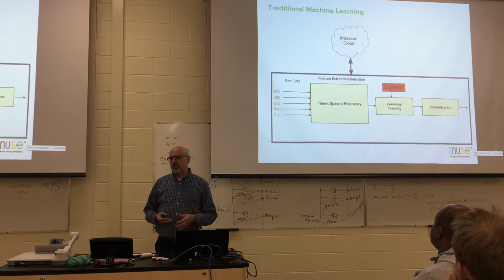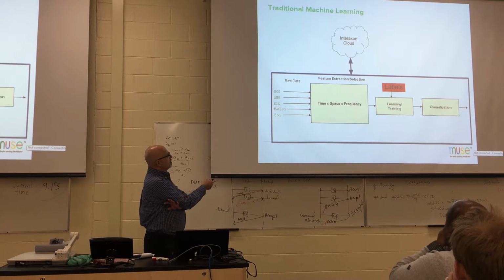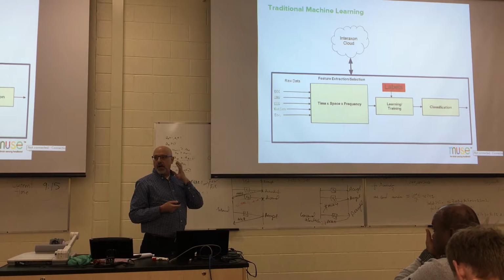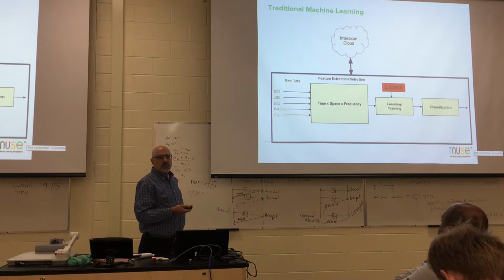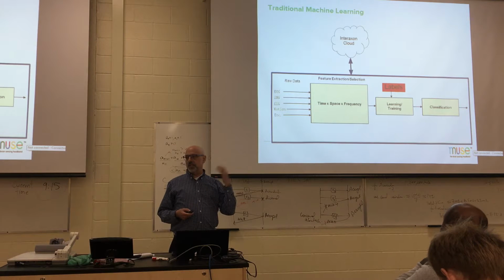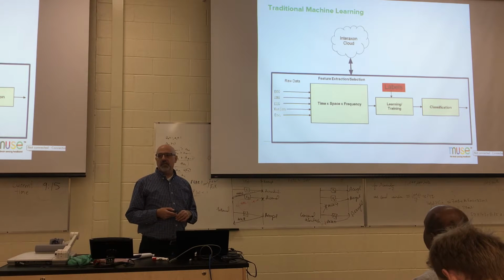So how we do it is using machine learning. Here on the left-hand side, I name the signal. EOG is electrooculography, which is the electricity that your eyes create. Your eye is like a dipole. EMG is electromyography, the measurement of electricity that your muscles produce. And EEG is the brain signal, and there's motion, and there's also sometimes even heartbeat.